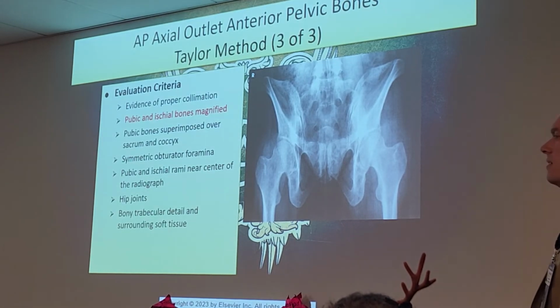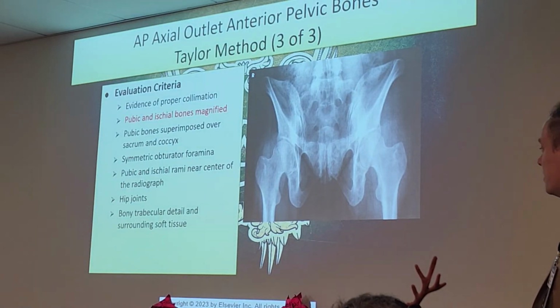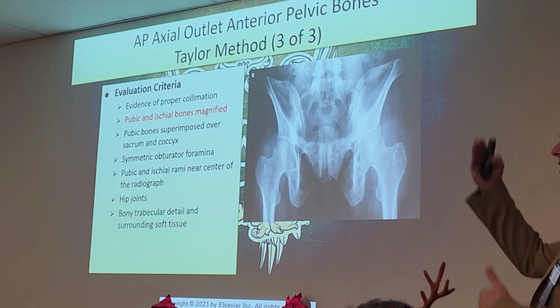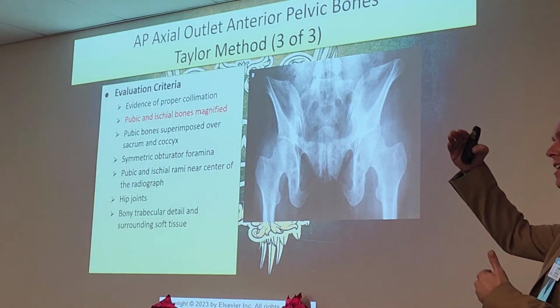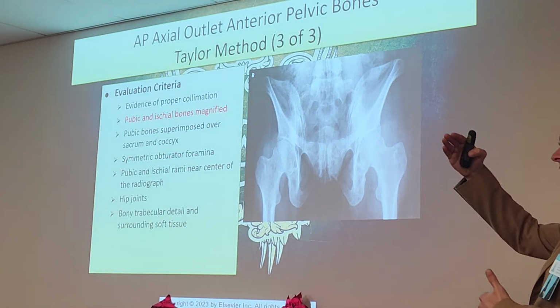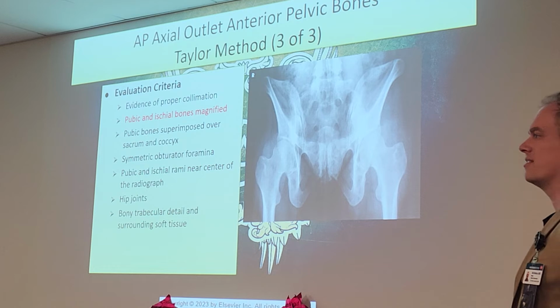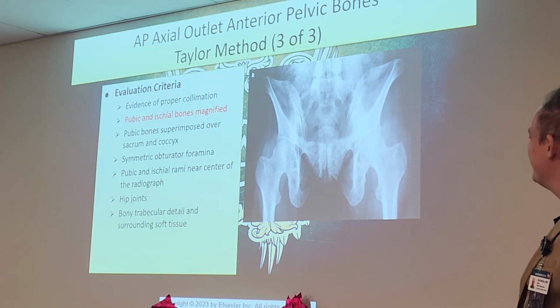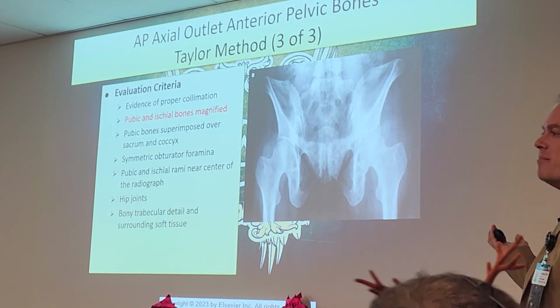Why does the head of the female look so fat? The neck looks fat and short. You tell me. Look at how everything else looks very elongated. Because we added an angulation. Stretches it all out. Like an evil bat? Yeah, it kind of does. It looks like a mask.